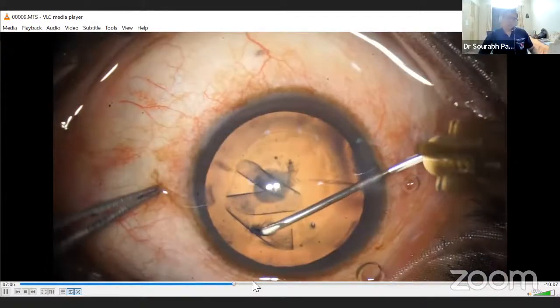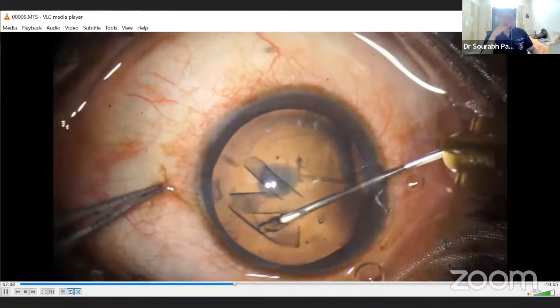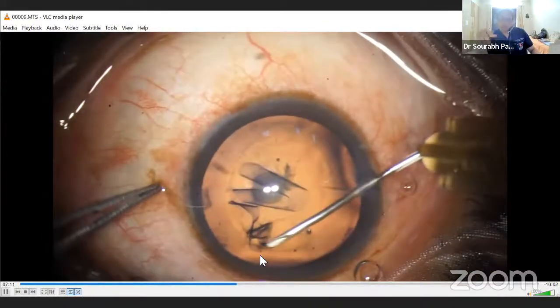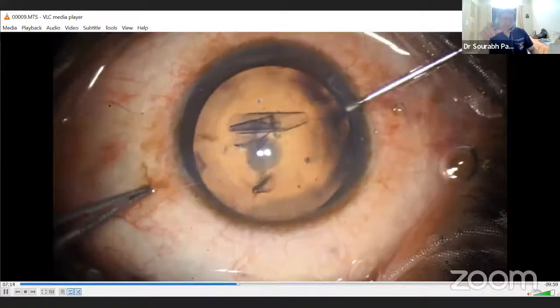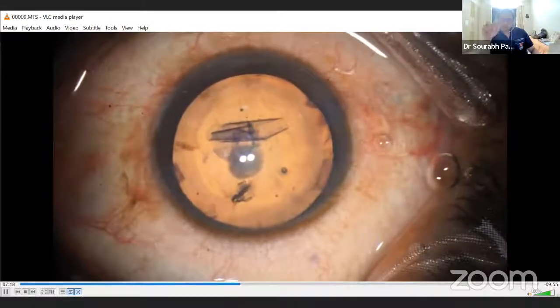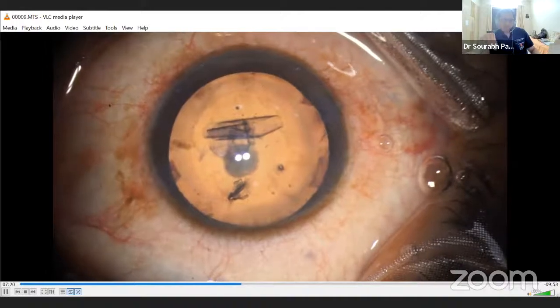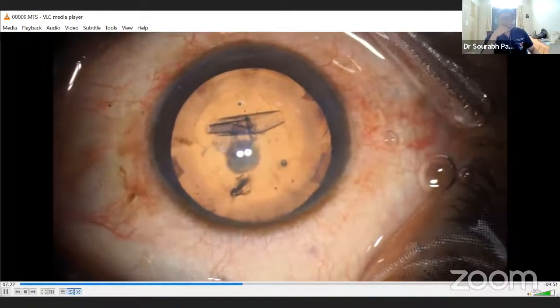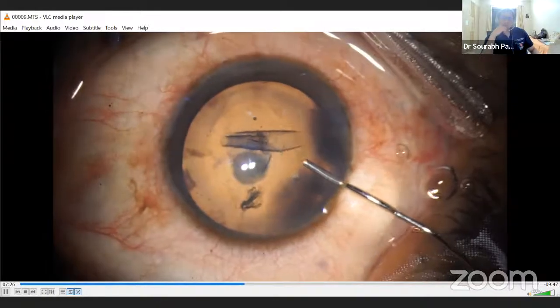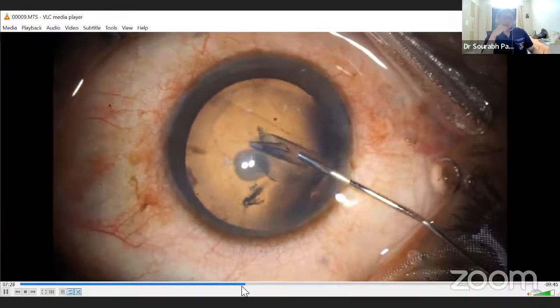Such patients you should observe very carefully on the slit lamp also. Or when you take the patient under the table, you just watch for the edges of this posterior subcapsular opacity. If they are very sharp, then there is a likelihood of posterior polar. But this looks fuzzy only. I don't know. It's not focused, so I can't say.